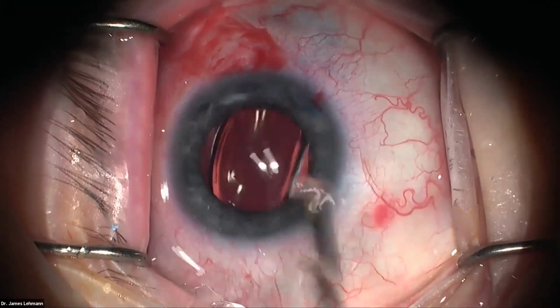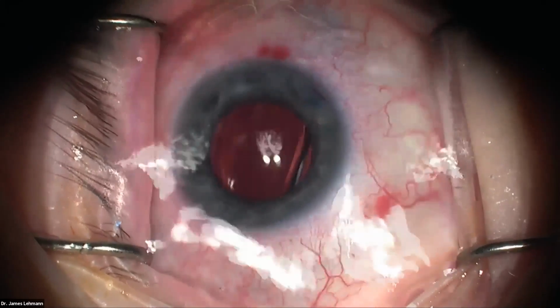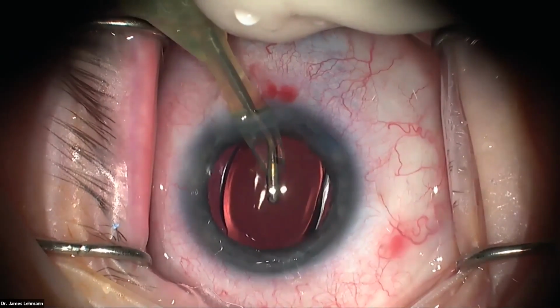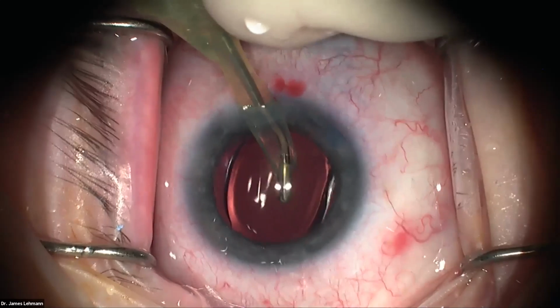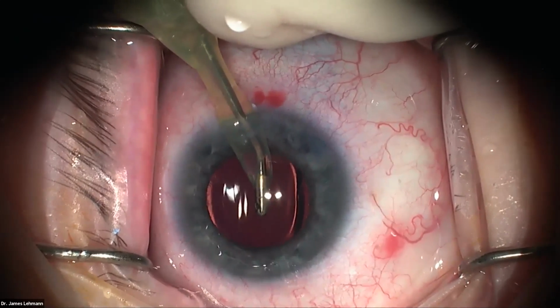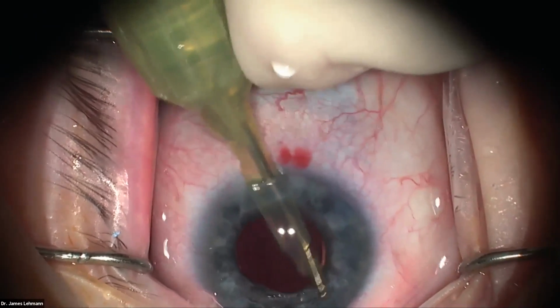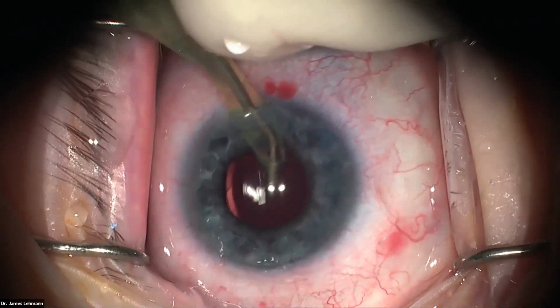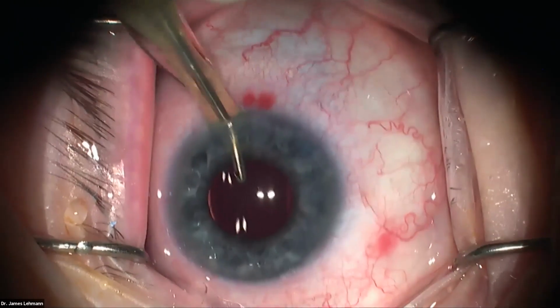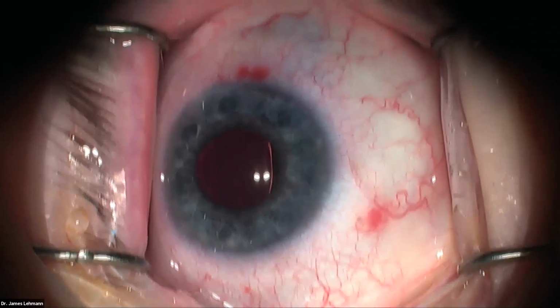Okay. And now we're going to do I/A and remove the remaining viscoelastic. Continuous irrigation on. I'm not going too fast here because you can cause a lot of movement of that lens until it's unfolded completely. If you're too aggressive with the vacuuming, it can sometimes make the lens bounce around, and I've even seen it flip. So removing all the viscoelastic. Okay, and we're good. I turn off my infusion, and then I'm going to hydrate my wound.